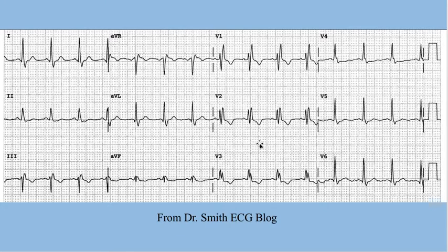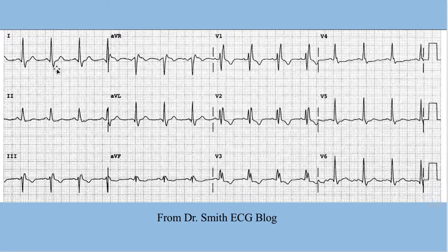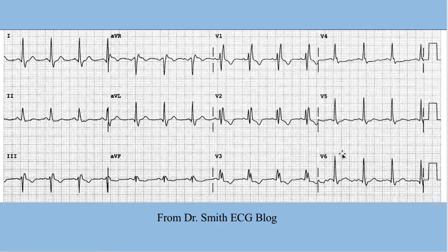Something else that could potentially be normal for right bundle branch block is in the lateral leads V6, V5, AVL, and I. You might encounter a big bulky T wave with ever so slight ST segment elevation in these leads when subsequent to a large slurred S wave — that could very well be a normal variant. It should be assumed to be new until proven otherwise in the right clinical context of acute coronary syndrome. Now, a lethal combination with right bundle branch block is a left anterior fascicular block appreciated here in the frontal plane.